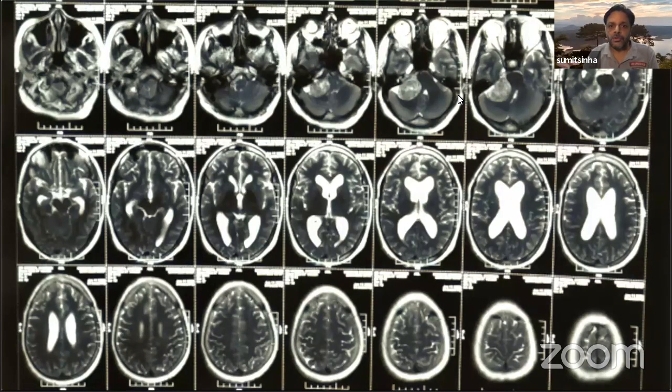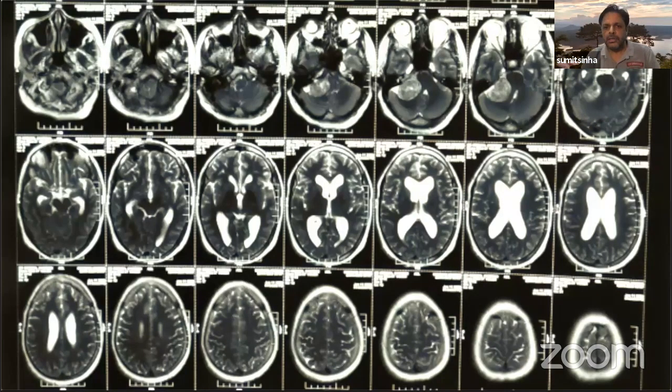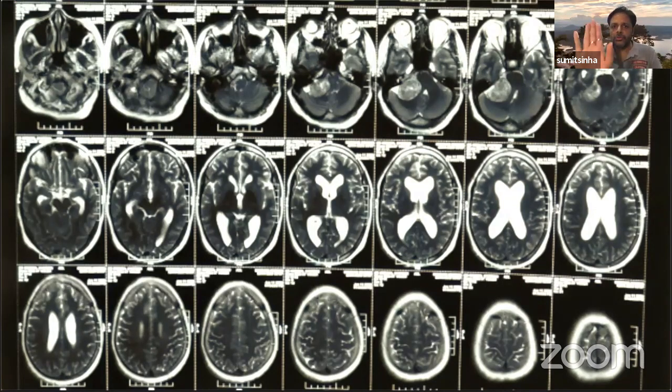The second important thing that you have to look for in the MRI of patients with these tumors is the extension of the tumor into the meatus. As you can see, there is not much extension of the tumor into the meatus in this patient. So I preferably am not pre-planned to drill the meatus in such a patient. If the tumor is very stuck to the facial nerve, I would electively choose to leave some of the tumor in the meatus because it is not going very much into the meatus. I will show you in the video shortly how I did it.